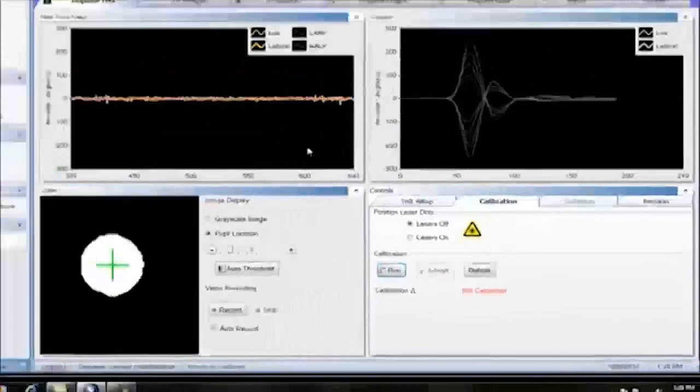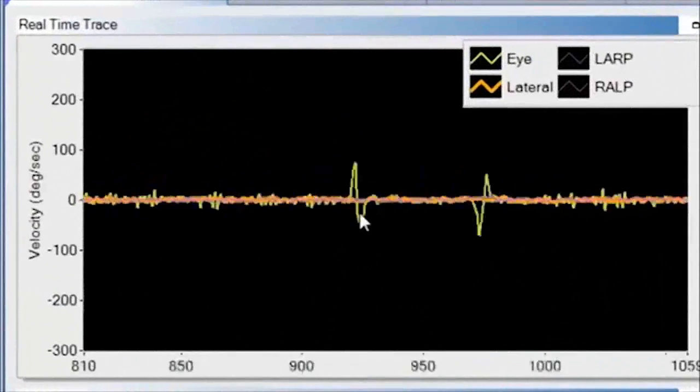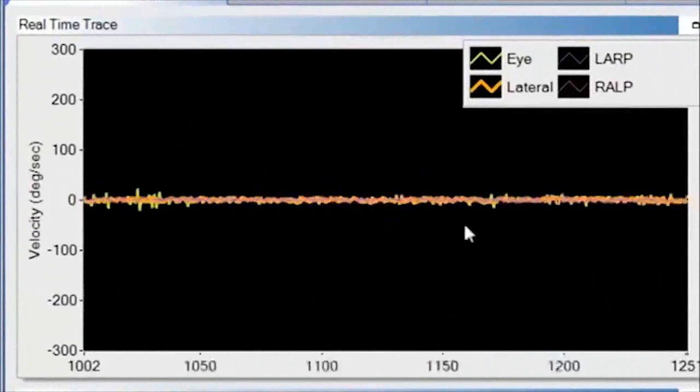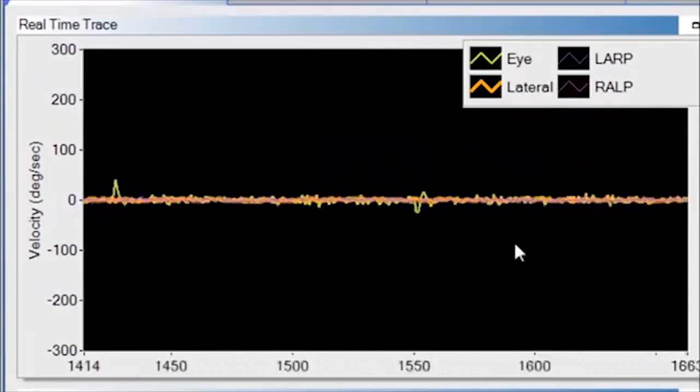Now you see the real-time trace. The orange is the head and the green is the eye.